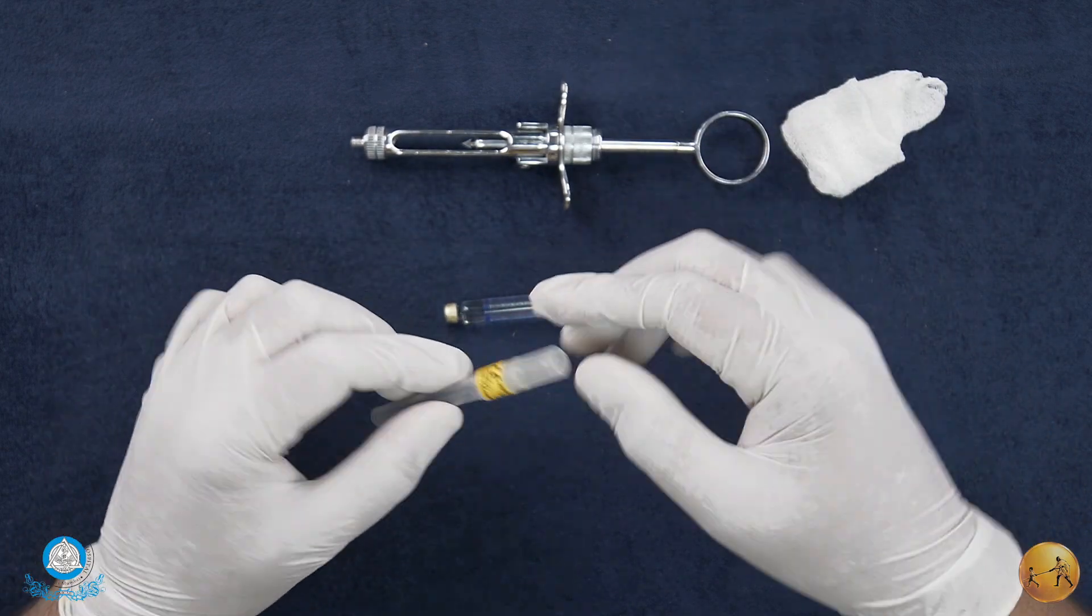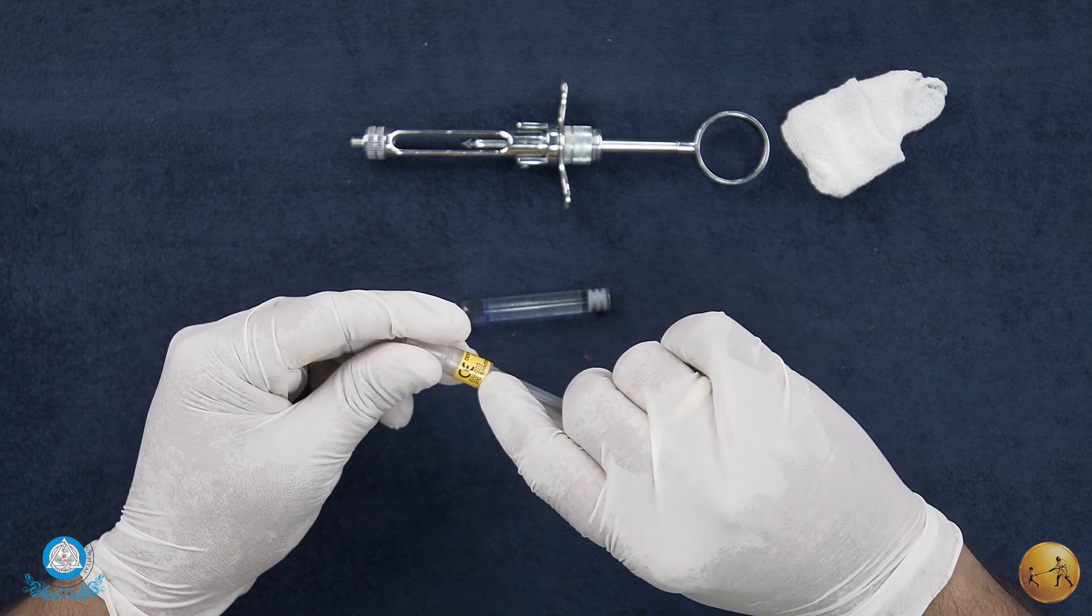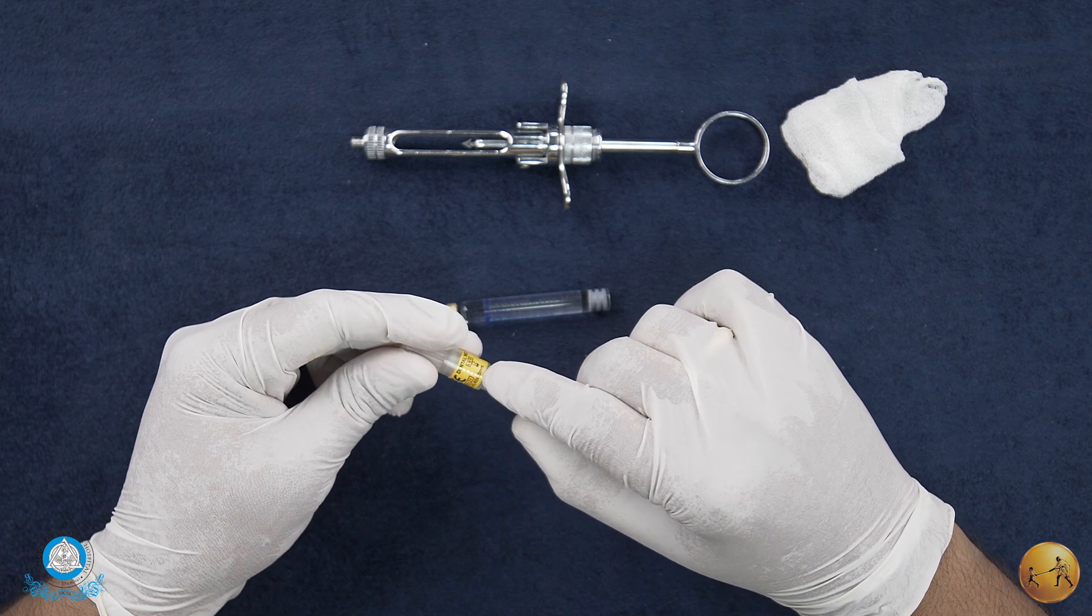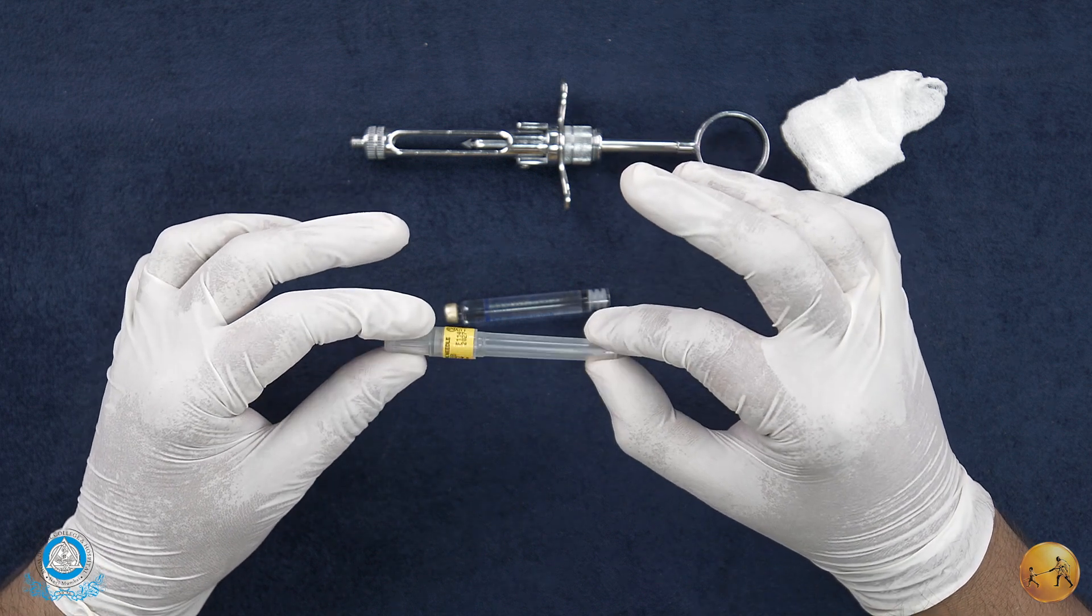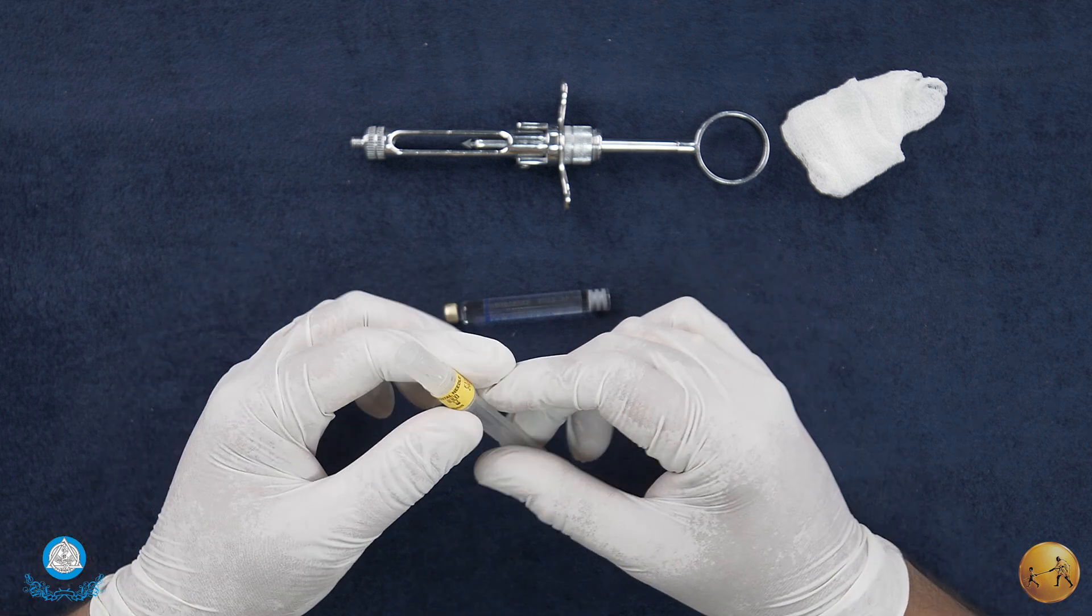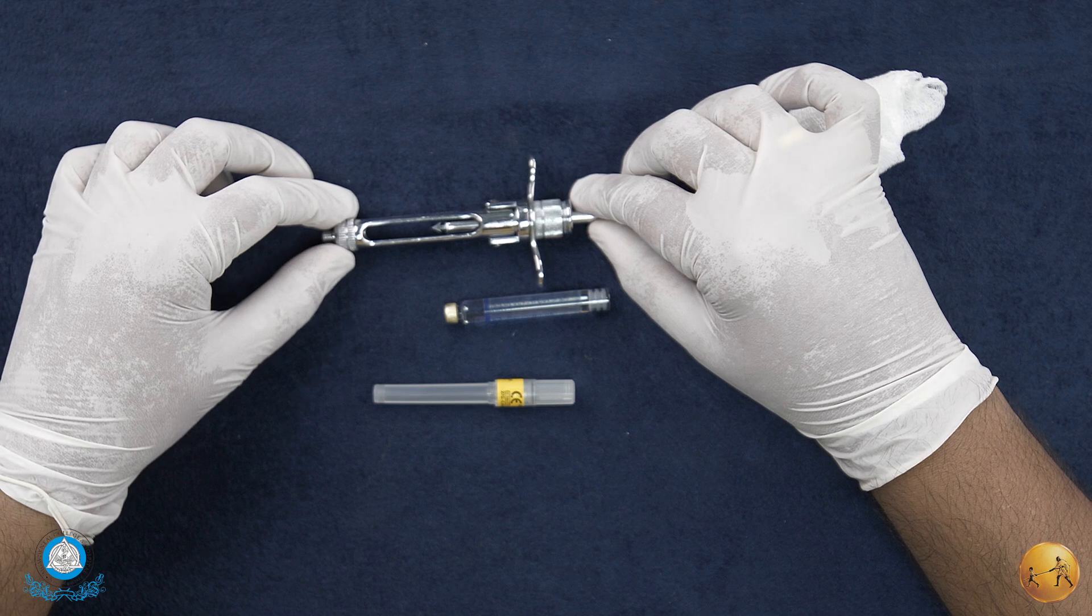This needle is sealed. If you are able to clearly see, it's a 27 gauge needle which is 35 millimeters long, and the sterilization is guaranteed as long as you do not open the seal. Also always note the expiry date of the needle.